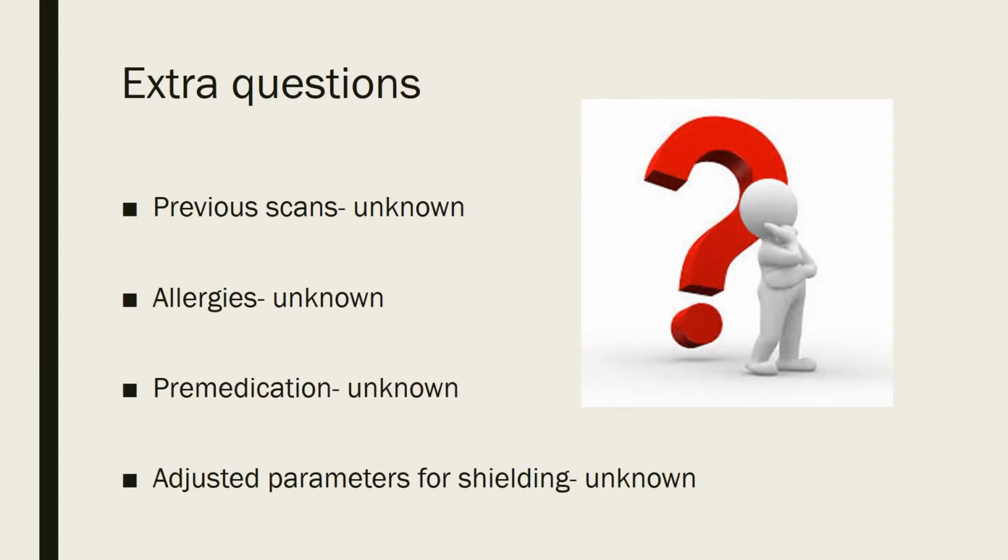A few questions that I didn't get to touch base on were whether there were any previous scans done that weren't covered, so it's unlikely. They didn't report any allergies to any contrast. This would be good since she had the intrathecal contrast injected.